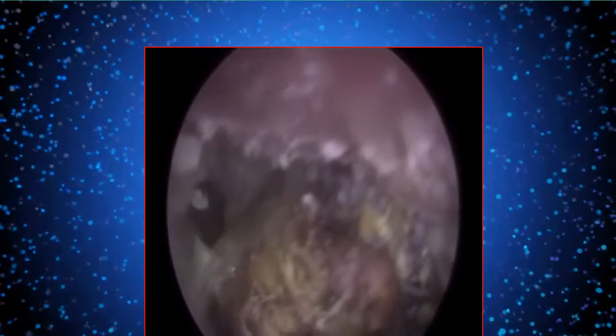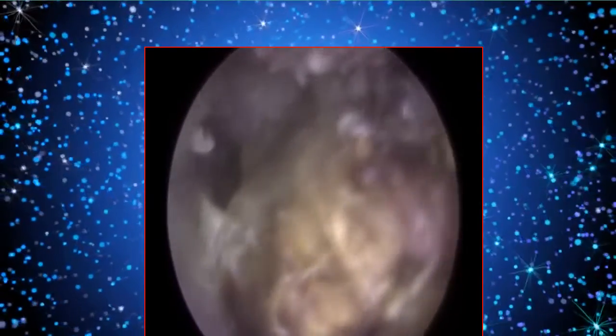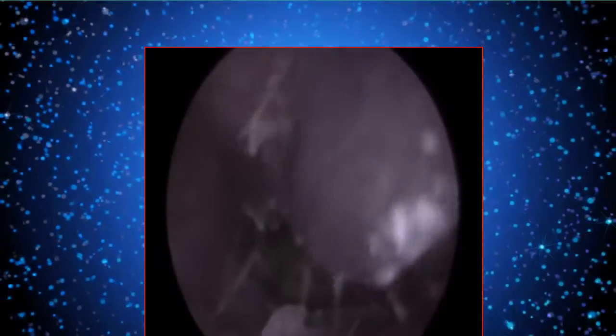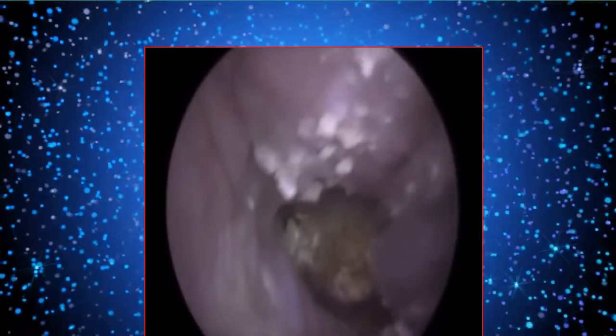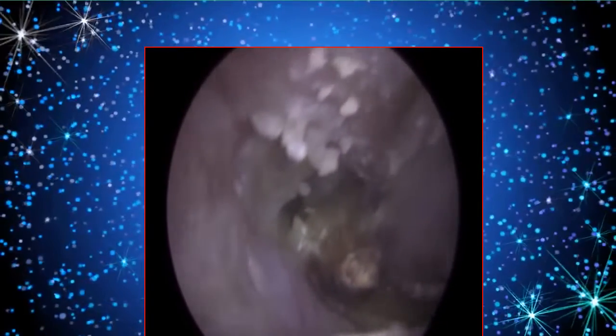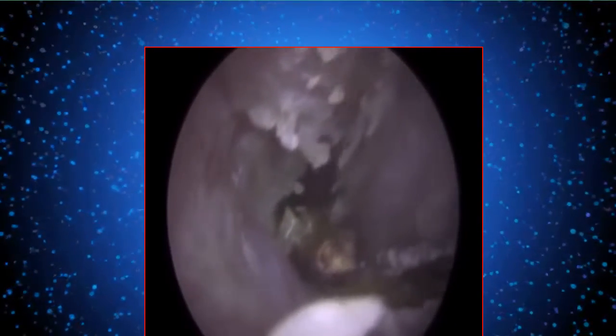So it's just lodged, it's really difficult to remove. There's a gap there at the back, so you can see some of the eardrum's exposed. In fact, I think I'm just going in with a normal Zöllner suction probe, because the fine end just wasn't powerful enough. So I've just about managed to squeeze it into the ear canal.